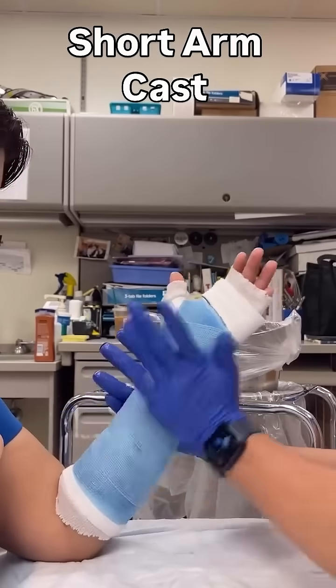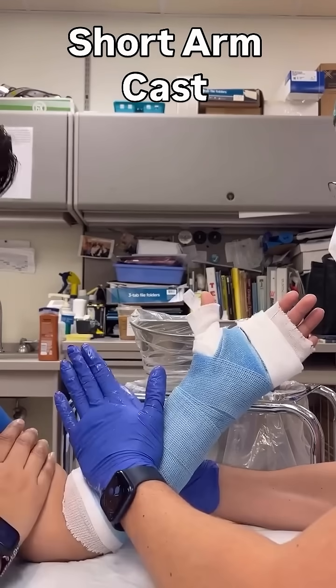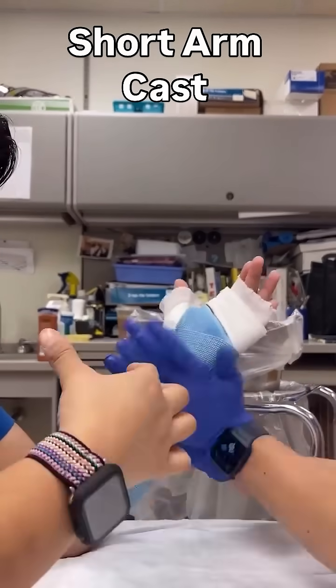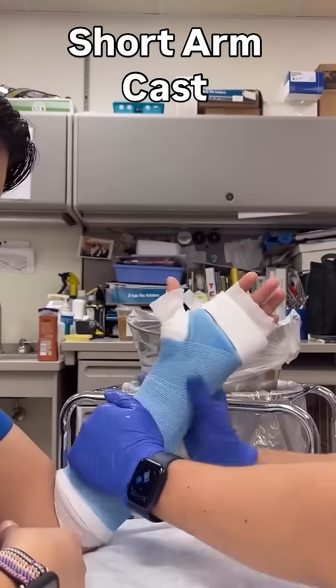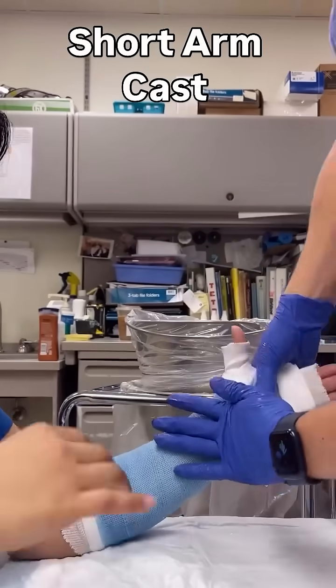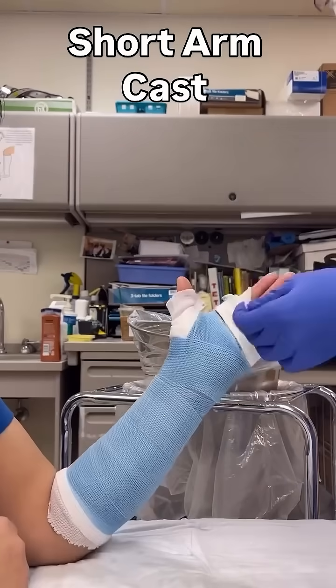Now it's time to create your mold. The goal is to have more of a flat cast rather than a round one, to prevent pronation and supination at the wrist. You also want to flatten the ulnar border and mold it snug to the hand so that the cast isn't loose. If you're trying to fix a deformity, you may need a different mold depending on the fracture pattern.